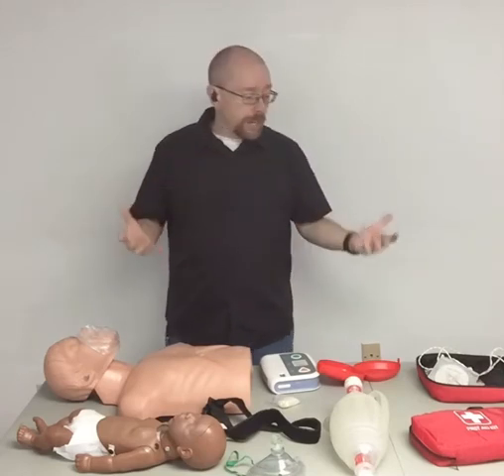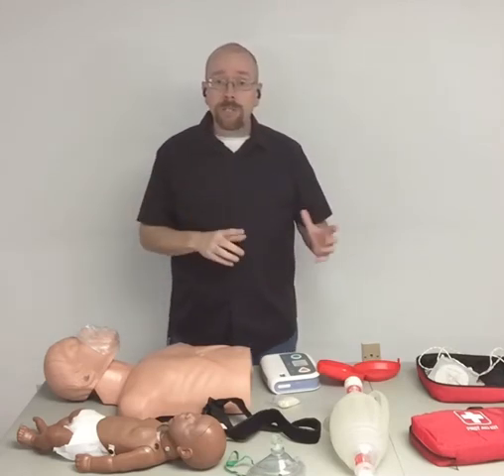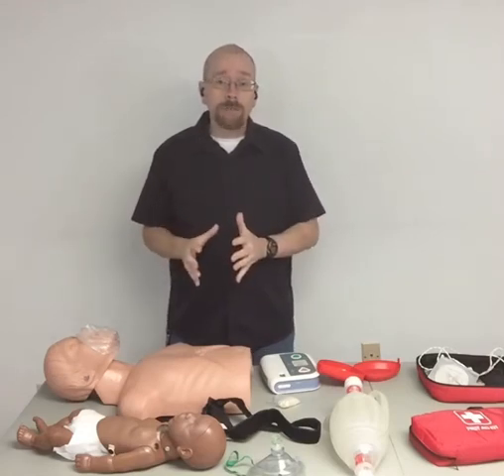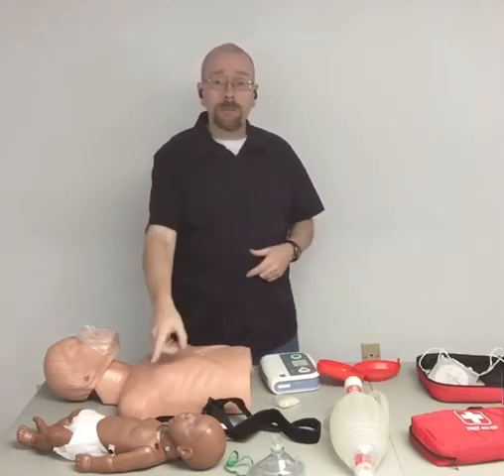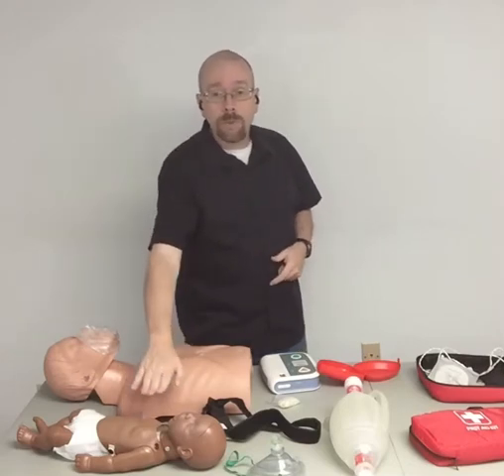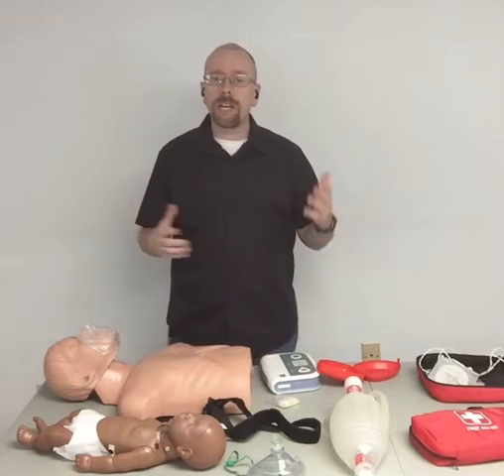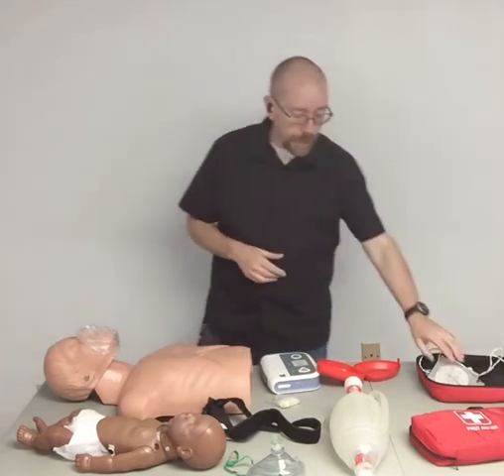If it's a pediatric patient, we're using the smaller pediatric pads, and if you don't have pediatric pads, you can use adult pads on a pediatric patient. We would just put one pad on the front and one pad on their back, just like the picture shows us in the pediatric pads.